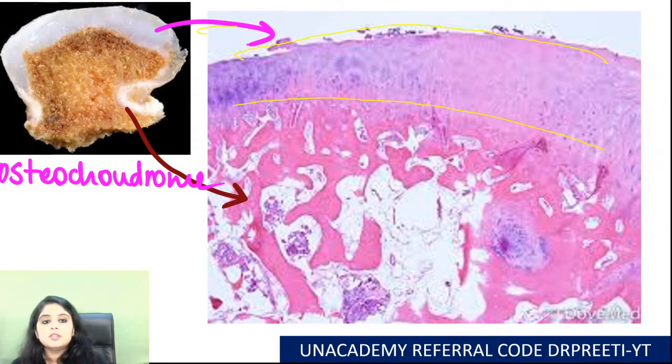Is everyone clear with osteochondromas? You agree that it's quite a classic picture. Once you see this mushroom shaped exostosis or osteochondroma, no one should forget it. And what did you learn? Glistening. Glistening is the appearance that you give to cartilage.